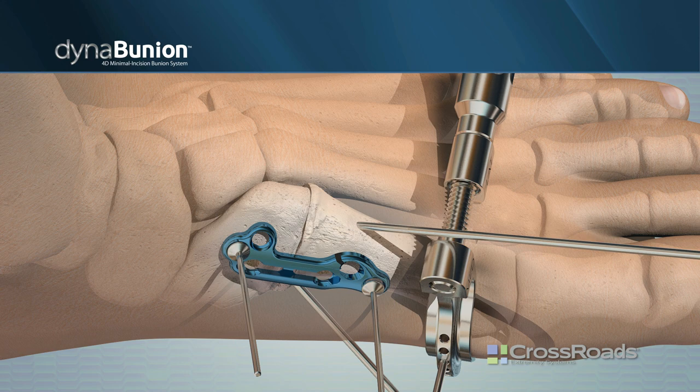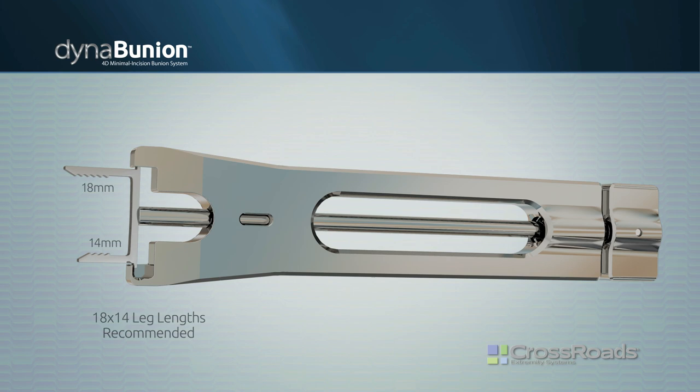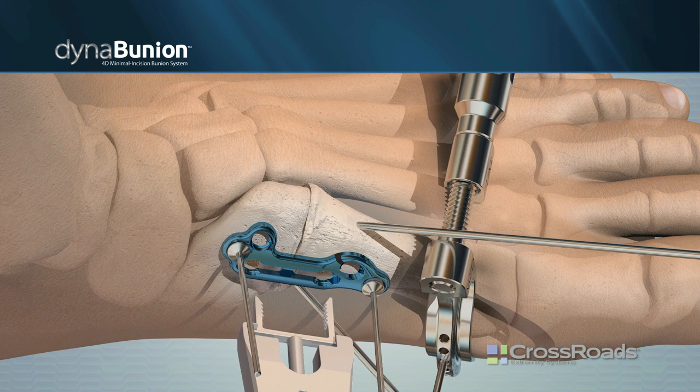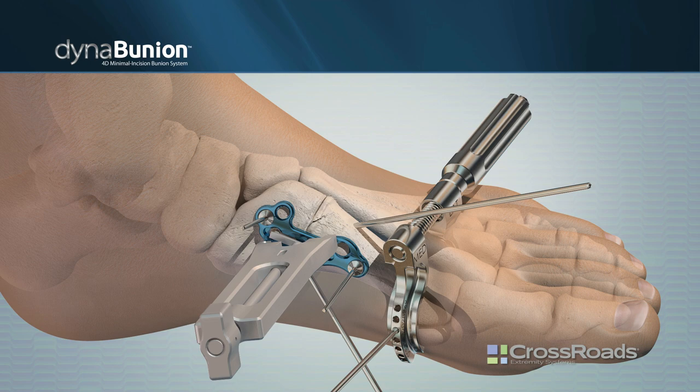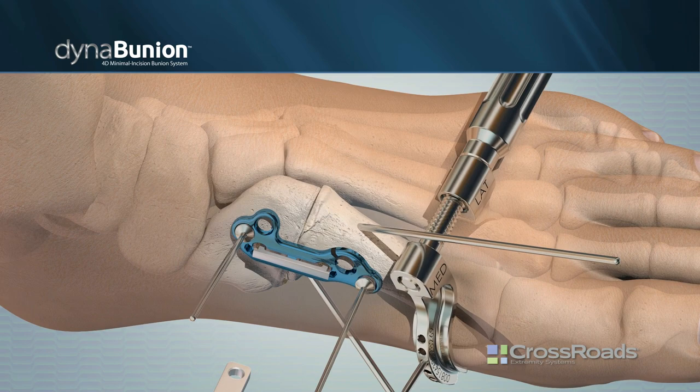Ensuring the legs are parallel, utilize the inserter to implant the Hymax staple through the plate until the staple is almost flush with the plate surface. Rotate the inserter knob counterclockwise until pressure is released. Then rotate the inserter counterclockwise until the staple releases. If needed, a tamp can be used to ensure the staple is flush to the plate.